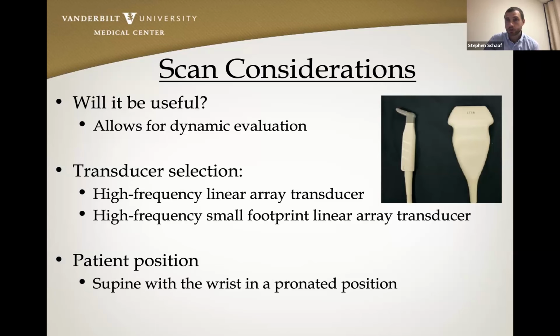And then in addition, just over the last several years, with the advances in ultrasound technology, the resolution for a lot of the transducers and machines is now at such a high level that it actually gives extremely good detail, especially for the ligamentous structures within the wrist and hand.